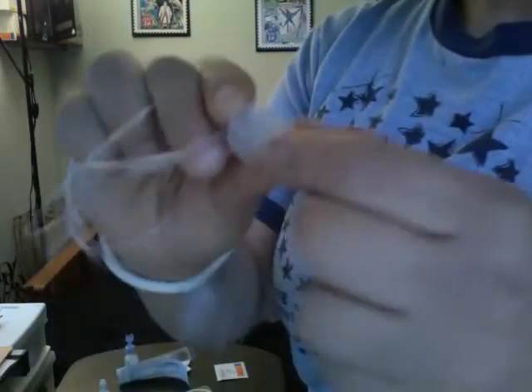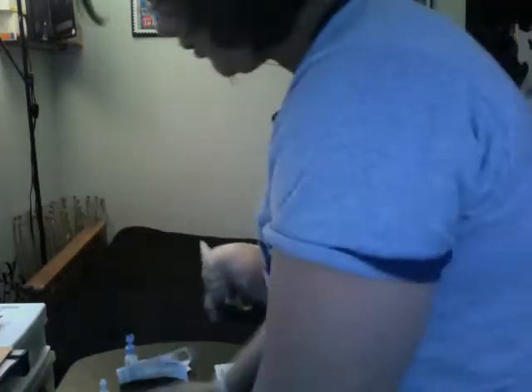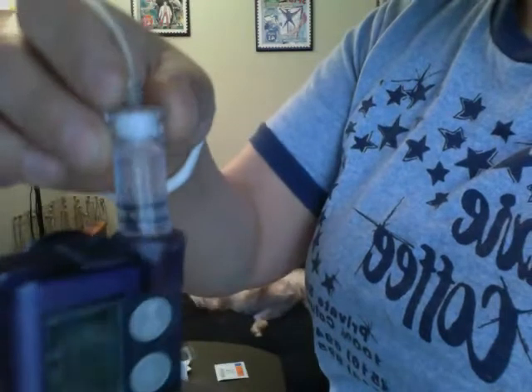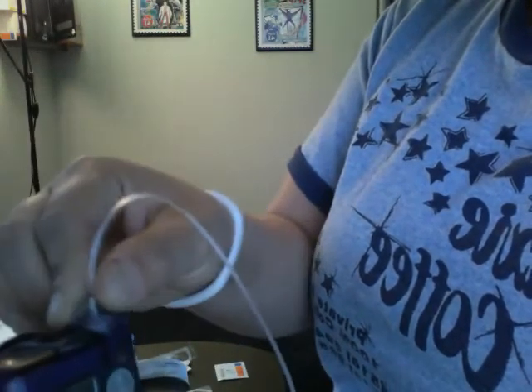Okay, I'll take my tape off. I'll take this protective piece off. And now my pump is rewinded, I hit act. It says preparing to prime. I'm going to install my reservoir. So you just fit it in and twist it so it goes in.